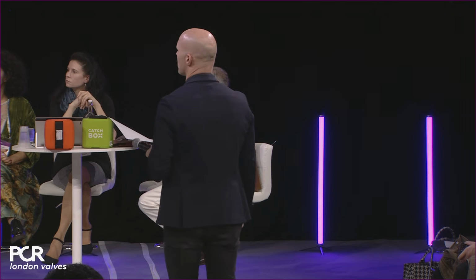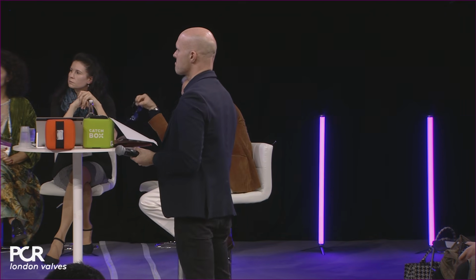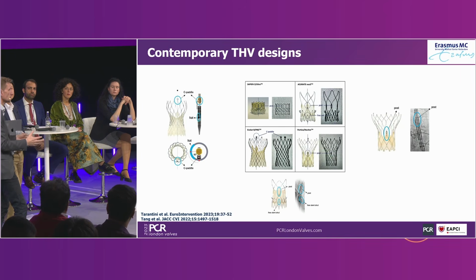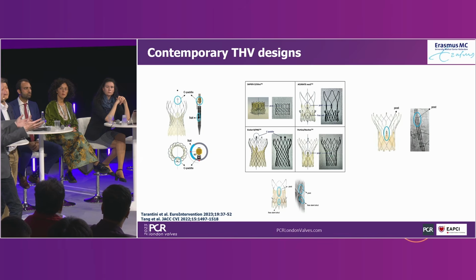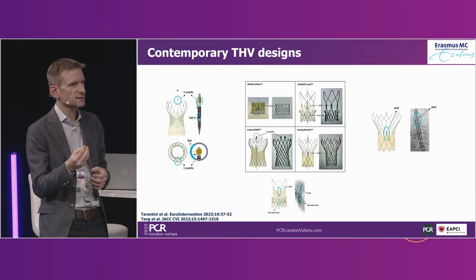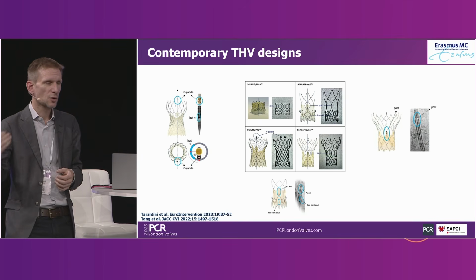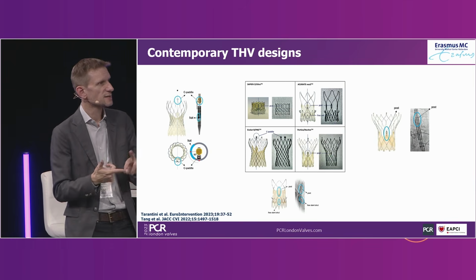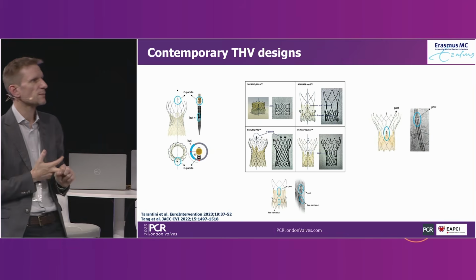But Nicolas, great. Before we go further on the commissural alignment, maybe there's a couple of questions, and maybe also from the panelists. You talk about valve to coronary distance. But of course, if you have the native anatomy of your patients, then it's based on some kind of assumption or simulation, because there's no valve in there yet. So what real value do you take home as a red flag? Is it low coronary? Can you take some cutoffs, or what rules of thumb do you use for coronary height, sinus of Valsalva, STJ? What makes you concerned? What if you see something on a CT where there's no valve in yet, native patients? What is a red flag?